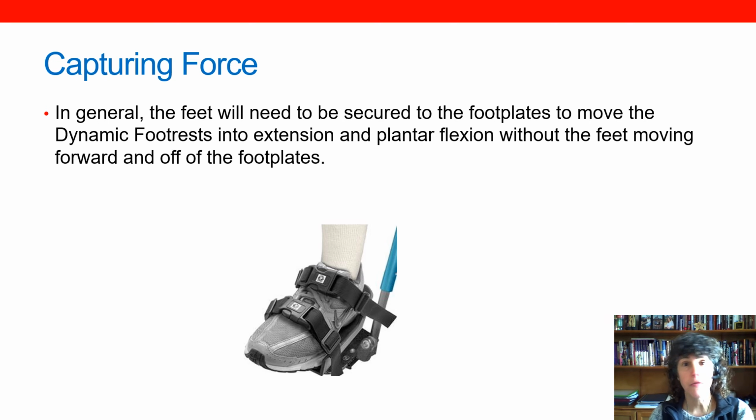In general, the feet need to be secured to the foot plate because otherwise when the person extends, their feet would simply move off of the foot plate. By securing them to the foot plate, the client is able to activate the dynamic components, telescoping, knee elevation, and ankle plantar dorsiflexion, depending on which features are present.